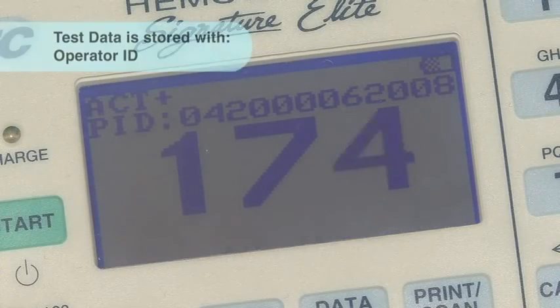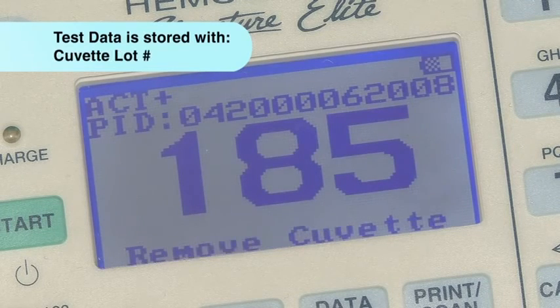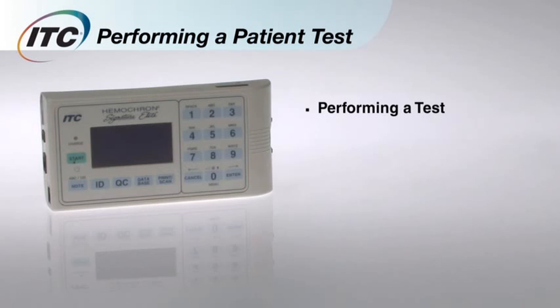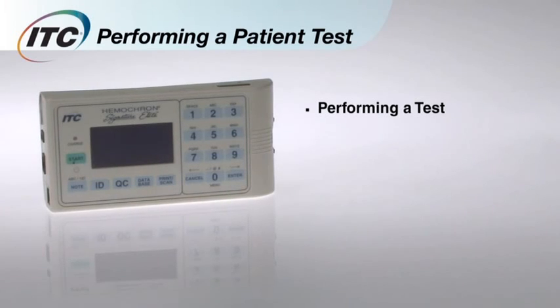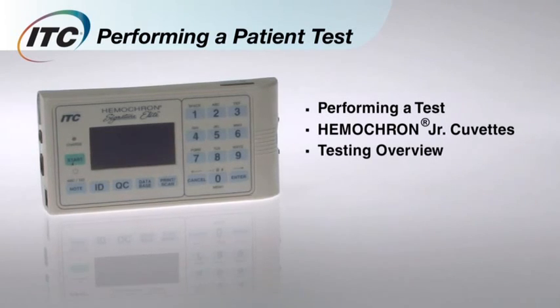When the test is complete, the clotting time will stay on the screen until you remove the cuvette. Verify that the test results are within expected values, and document the test results according to your institution's protocol. That's all there is to it. In just a few minutes, you've learned how to perform a patient test using the Hemocron Signature Elite, learned more about the Hemocron Junior Cuvettes, and how Elite gives you fast, accurate results right at the patient's side.